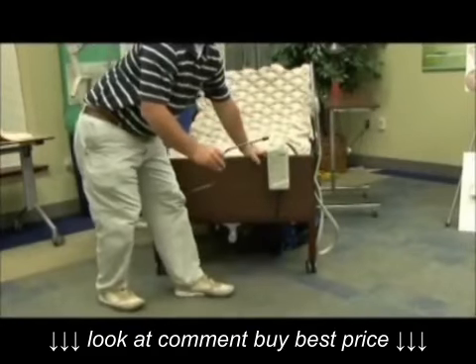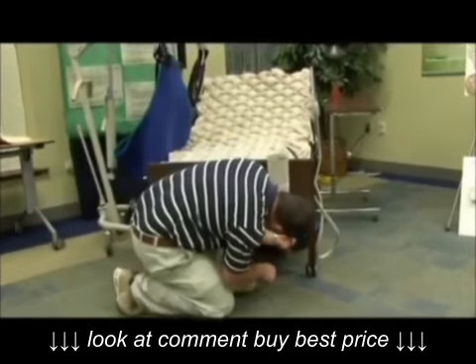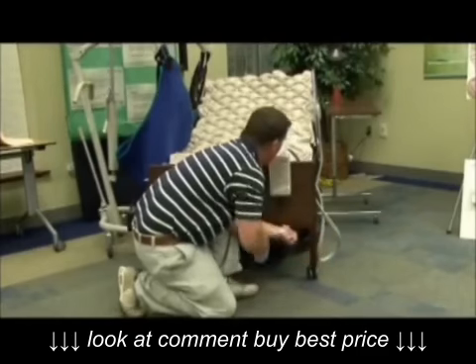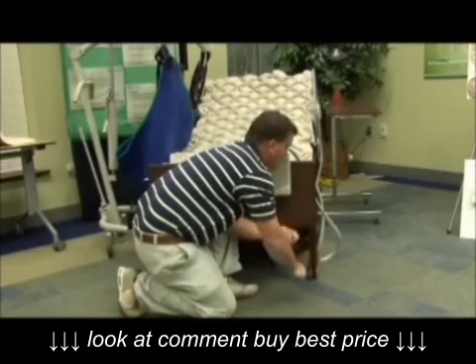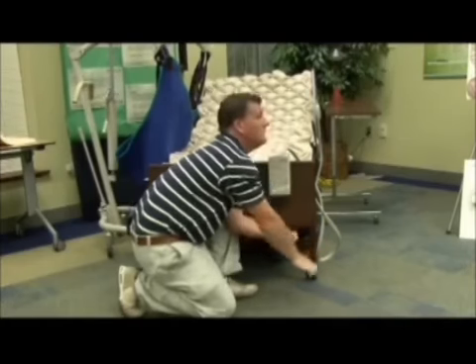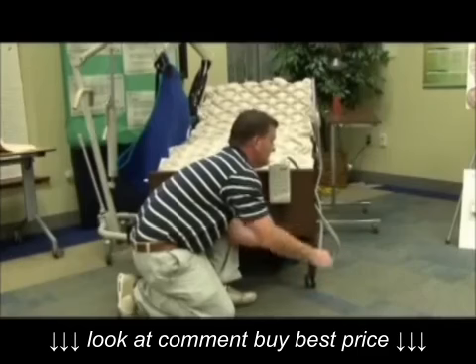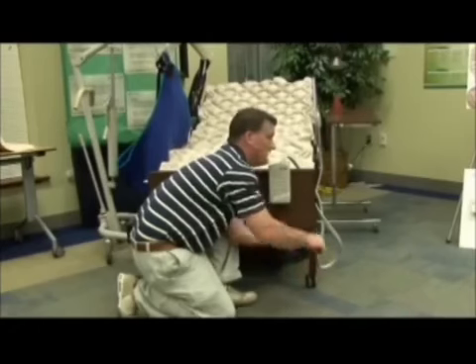Now I'm going to adjust the foot to my desired height. Simply attach it to the end of the motor. When you turn it to the right, the foot will start to raise. Turn it to the left and the foot will go down.